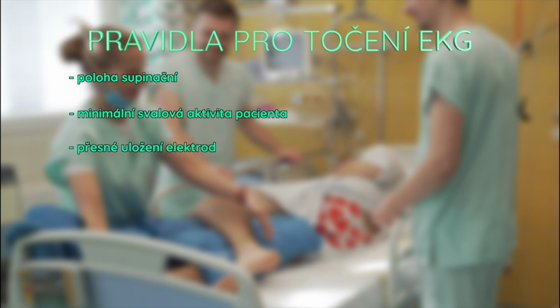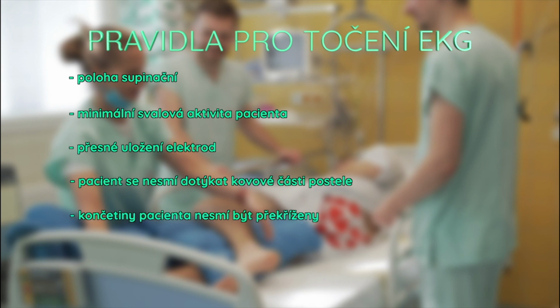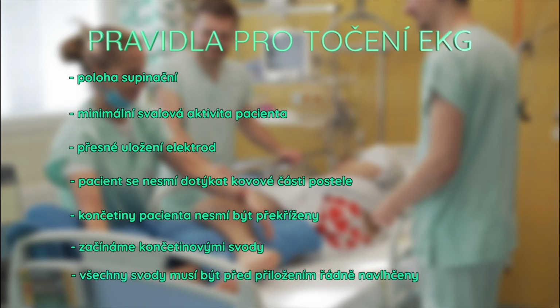Correct placement of the electrodes. The patient must not touch any metal parts of the bed. The patient's limbs must not be crossed. We begin with the limb leads. All leads must be properly moistened before being applied.